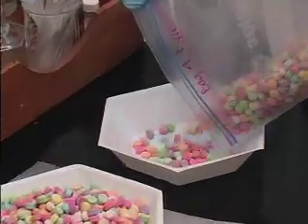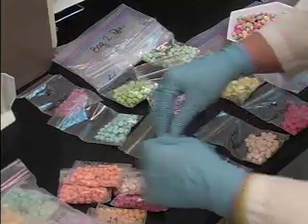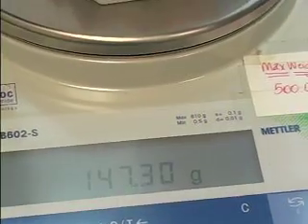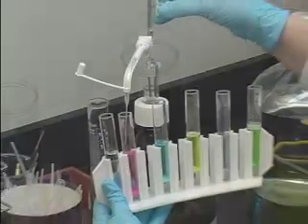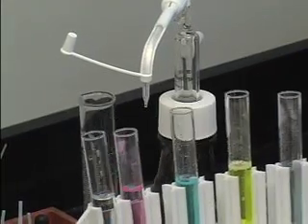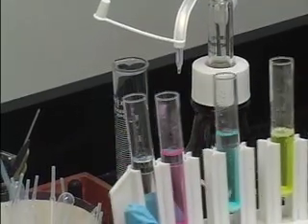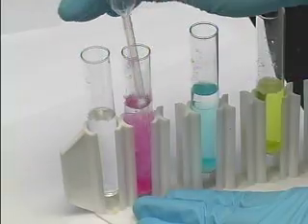The majority of our testing is qualitative testing. In qualitative testing, the identity of a drug is determined. Lab scientists also provide the weight of submitted substances to the customers in an official report. In some instances, the law requires a quantitation of substances, and in those cases, we will run testing that determines the purity of submitted drugs.